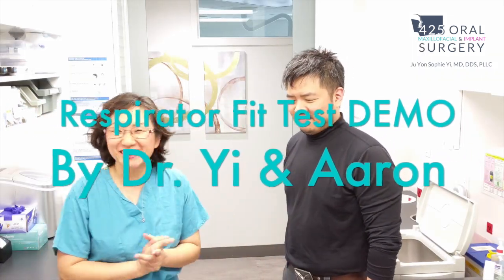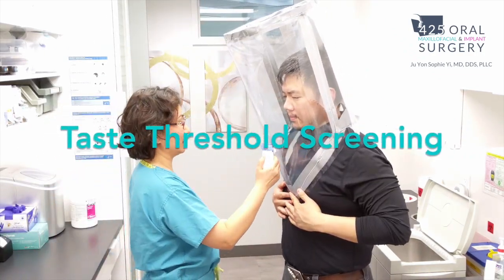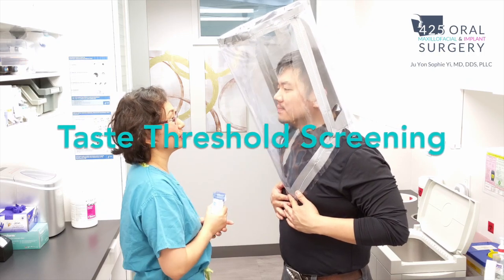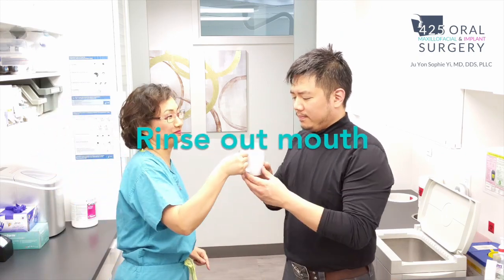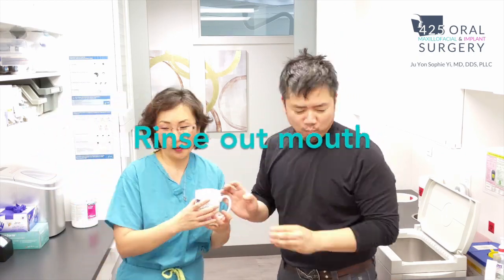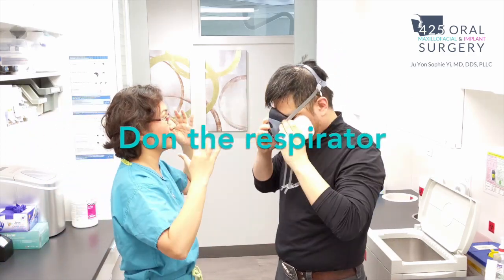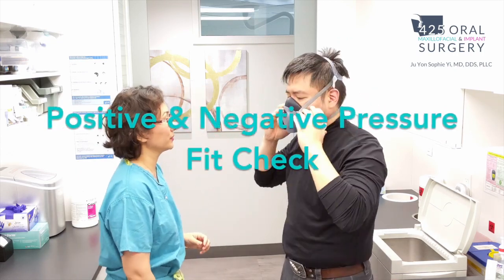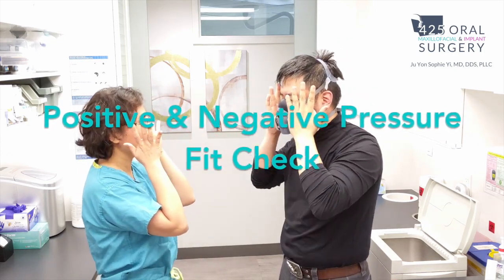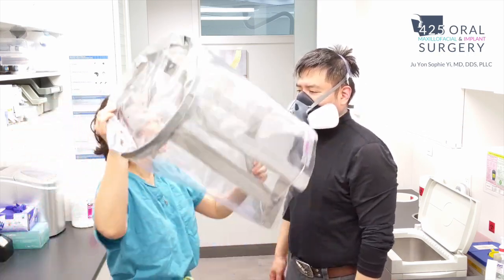This is a respirator fit test demo done by me and Aaron, my husband. First, you have to do a taste threshold screening to make sure they can taste the sweetness of the saccharine under the hood without the mask. Then have them rinse their mouth out to get rid of any residual sweet taste. Then they don the respirator properly and perform a positive and negative pressure fit check, closing off the valve and breathing in and out, making sure there's no air leak.